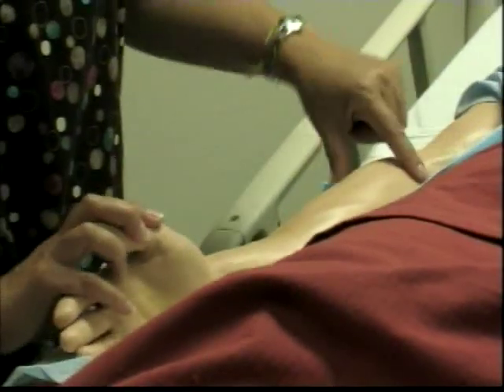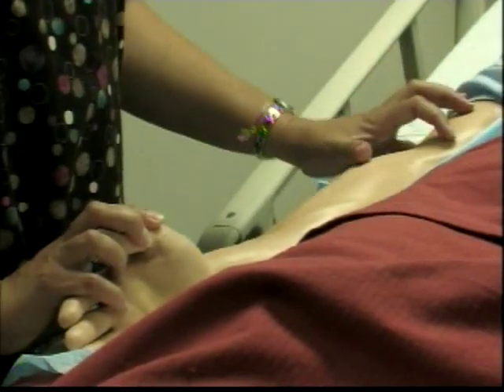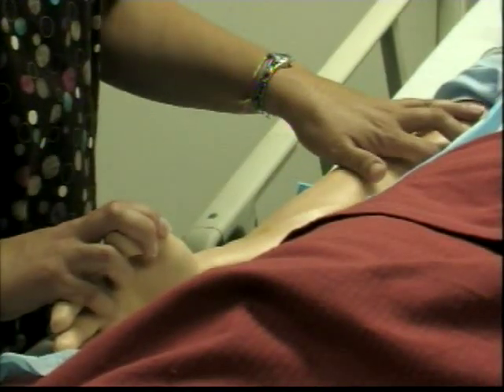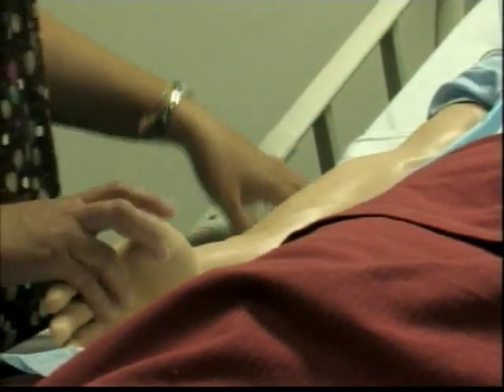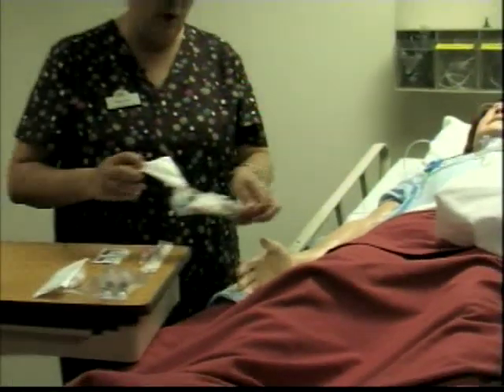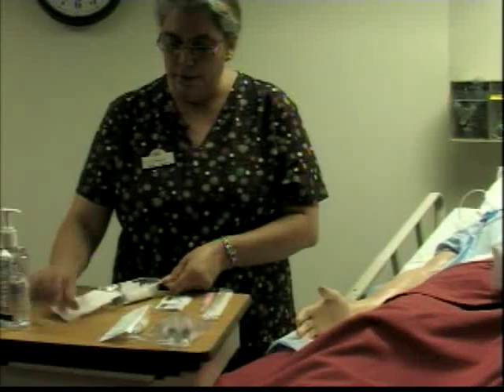If you started up here and it gets infiltrated and all this is swollen, you cannot come down here and start an IV because you actually will be aggravating the infiltration. So you're going to have to move to the other extremity. So you'll open your packet. You already had explained the procedure to your client, and wash your hands. You open your packets and have everything available to you.